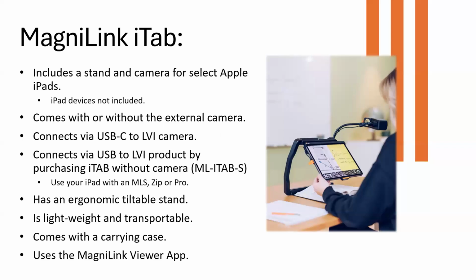If you're wondering, well, why would I buy a stand? Kimberly, I could just use any stand that I have for an iPad. That's correct. You can surely do that. Our stand is ergonomically set up to where you can split the screen, and that's what this student has done here in the picture, to where the camera on the iPad is in kind of a unique place, and you need to be able to have that stand angled properly where you can put a book or something underneath it to be able to split that screen and use the distance camera at the same time. So that's the beauty of the stand, is how it ergonomically works.